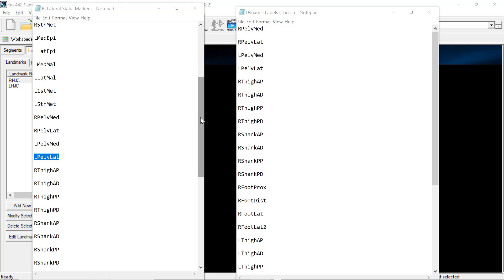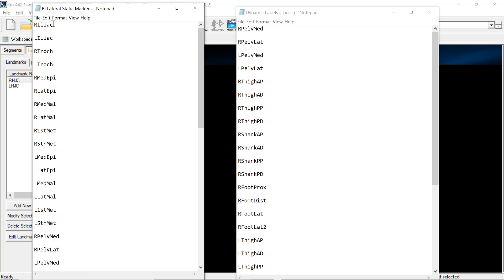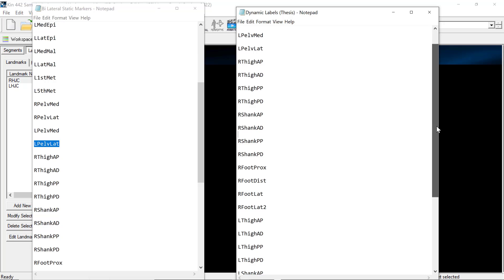As we discussed when talking about QTM, one of the main things you want to pay attention to when processing your QTM files on Qualisys is you want to make sure that your clusters match up from your static and your dynamic. One of the things that will be the difference between your static and your dynamic labels is that you're going to have those single markers added in the static — the iliac, the troque, the epicondyles, malleoli, first and fifth metatarsals — but everything else will have the same naming for your clusters as your dynamic labels.